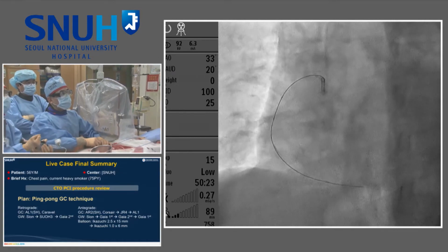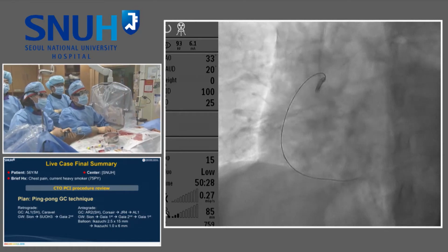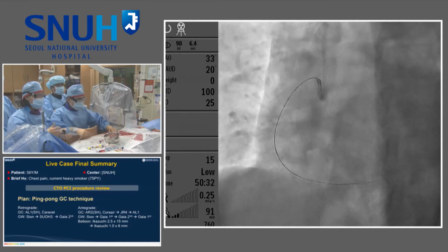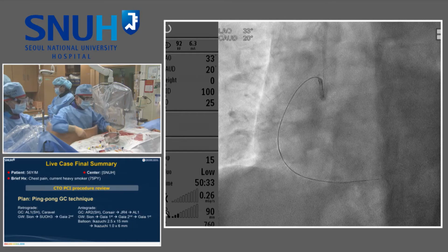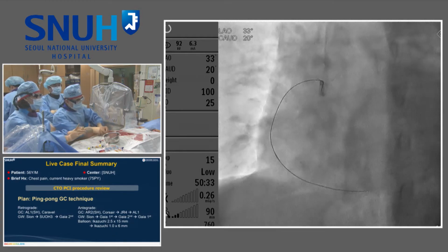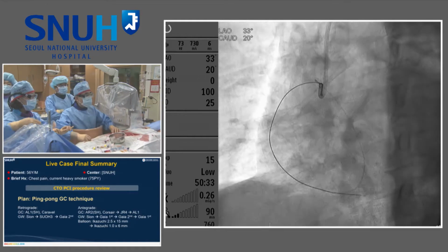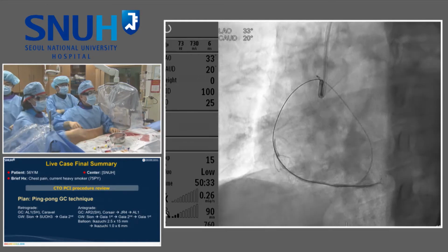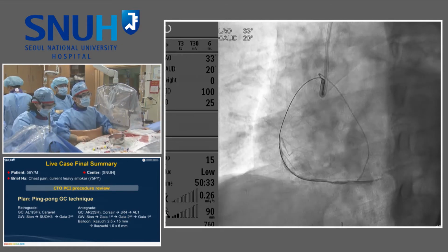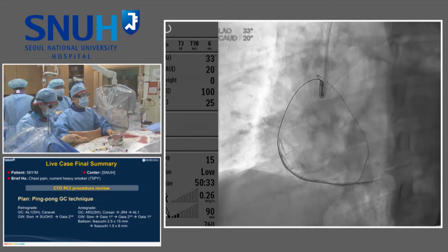Earlier the first one passed distally but the second did not. Inflation. Deflation. Okay, what kind of wire at this moment? So I passed the wire and checked the ante-wire in the true distal lumen like this by injecting dye into the retrograde microcatheter.